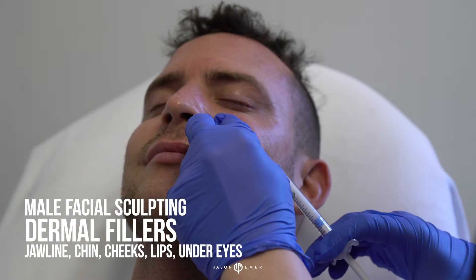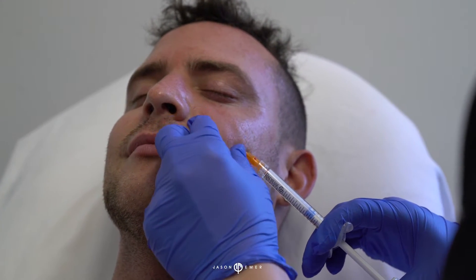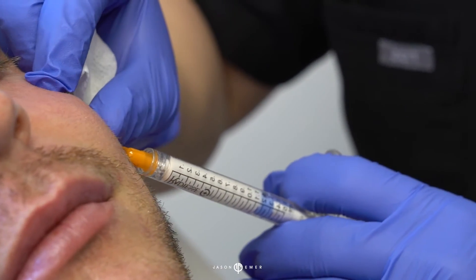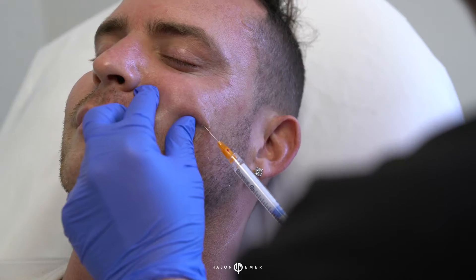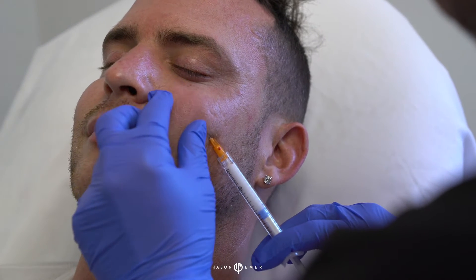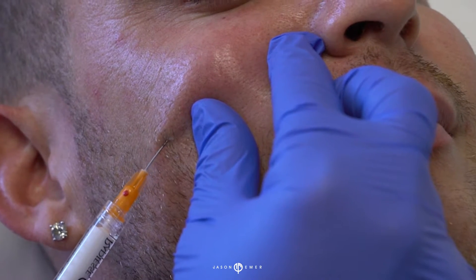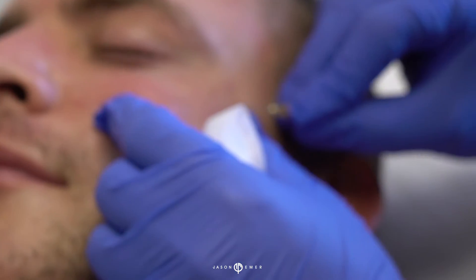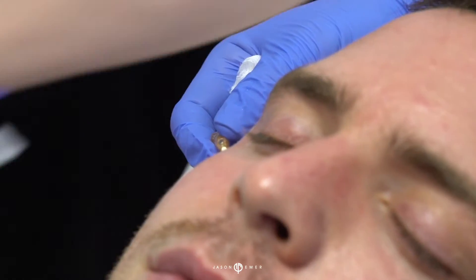The patient doesn't need much at all — we're doing very little. This is just shaping, using a filler a little deep into the upper cheek to lift so that his under eye improves, giving him some more contouring in the mid face. Right here I'm using Radiesse, and the reason I like this filler here is it builds a lot of collagen. With the cannulas, we're going in multiple directions to get some lifting effects.